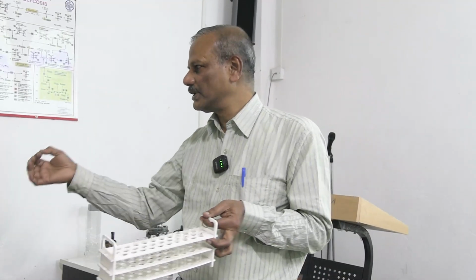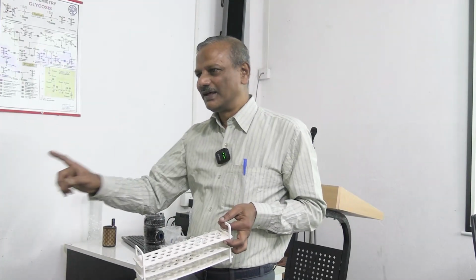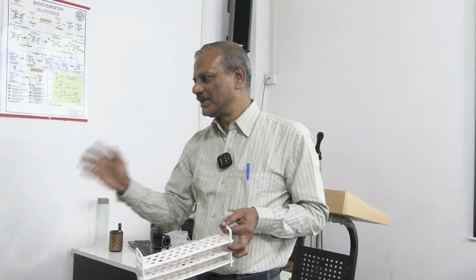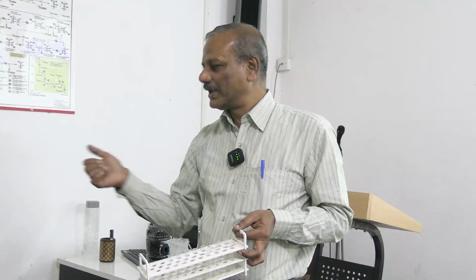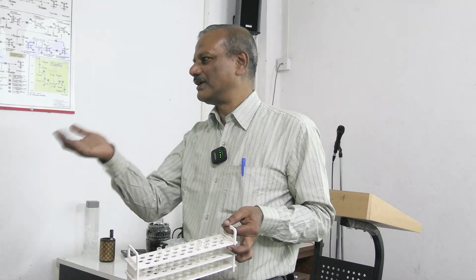For each sample you have to use a separate tip, because your blood sugar might be 400, his blood sugar might be 900, and his blood sugar might be 300. Now, suppose yours is 400 and his is 100. If I use the same tip and you don't wash it very thoroughly, and washing will take a good amount of time, it has to be washed thoroughly. If it is not washed properly, suppose her blood sugar is 100, it will simply reflect 130. Unnecessarily 30 milligram will be there, because the other blood sugar level is 300. It can be 400. So there will be contamination. It is better to take a fresh tip, so that you need not wash it thoroughly, and discard it. Simple. Okay.